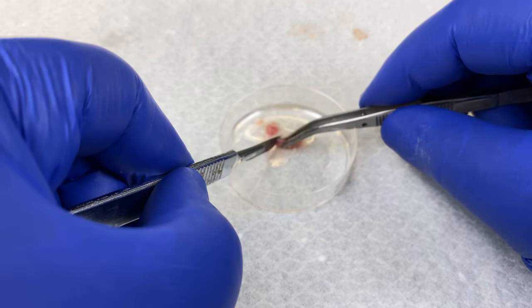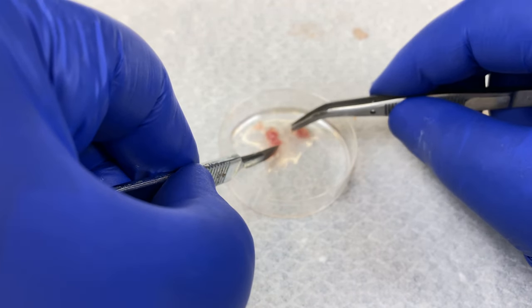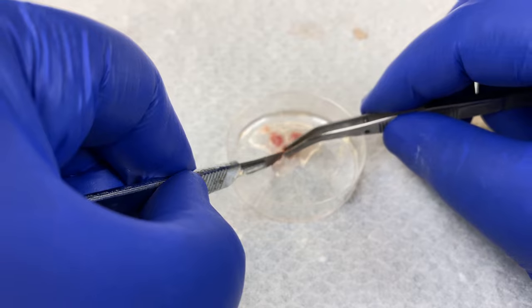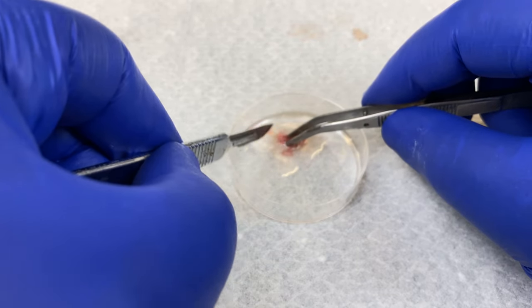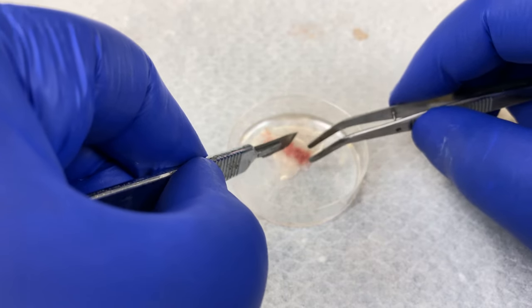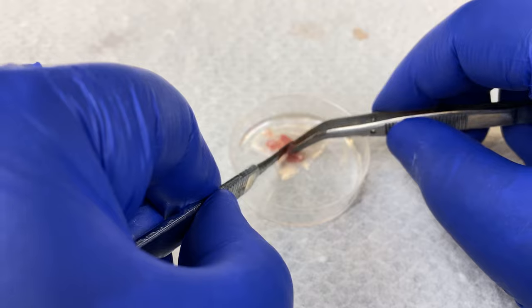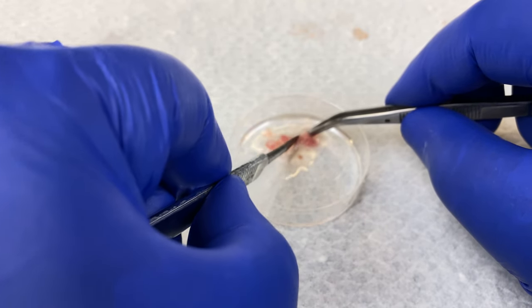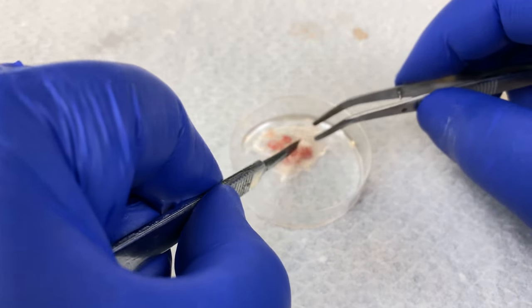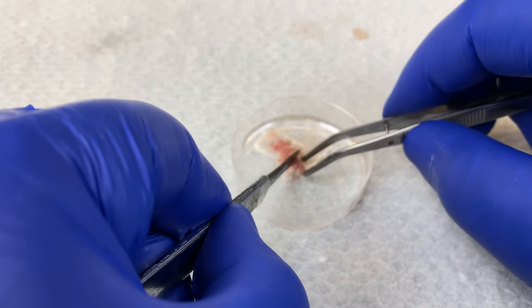I apologize for it being out of focus — it appeared to focus in on my hand, not on the tissue itself. We'll use three methods of disaggregation in this video. The first is explant, where we'll take these cut-up chunks, place them into a dry, fresh dish, and adhere the tissue to the dish.